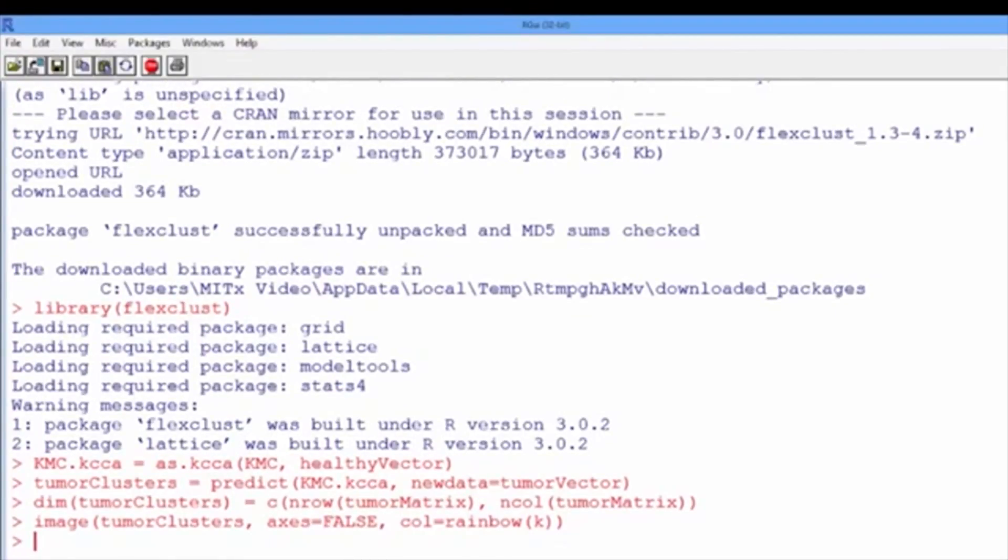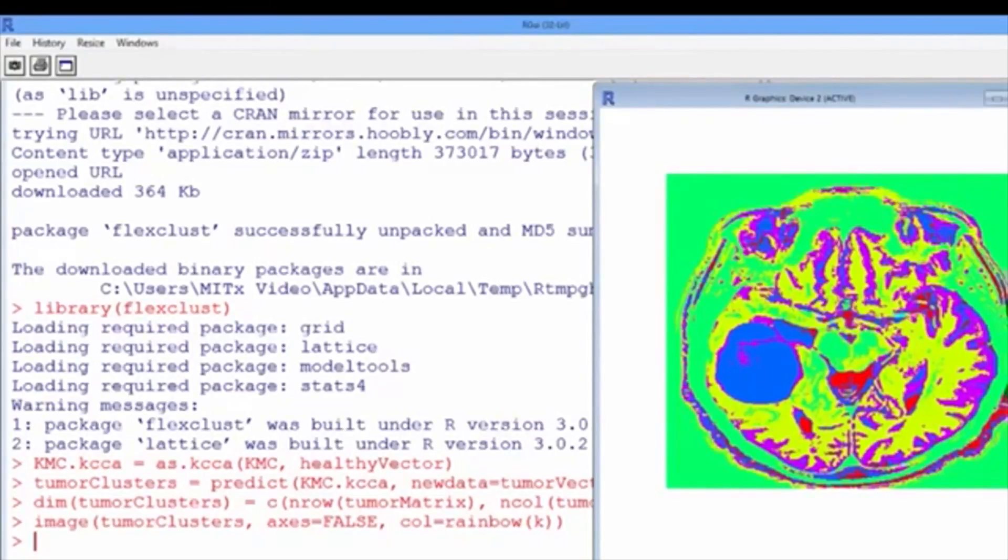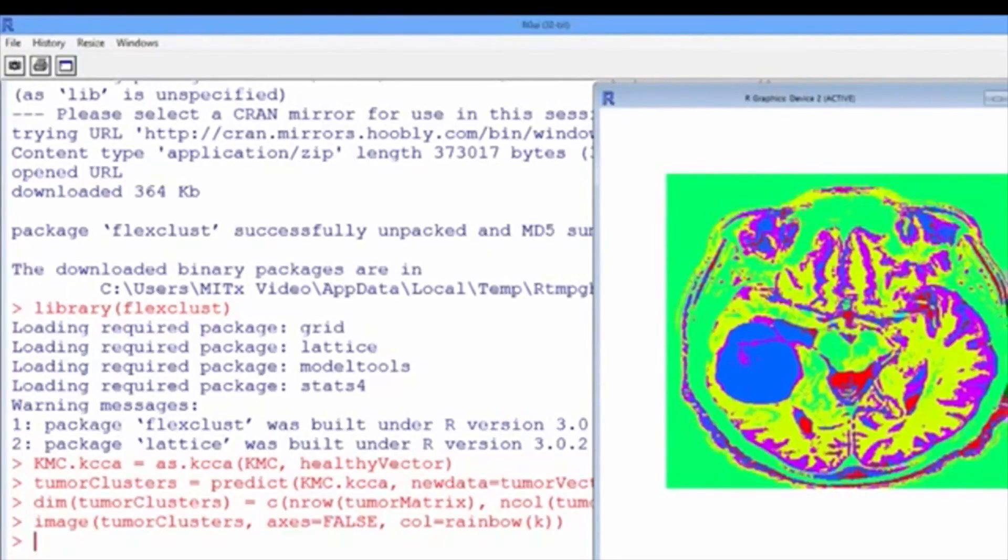All right. Let's navigate to the graphics window now to see if we can detect the tumor. Oh, and yes, we do. It is this abnormal substance here that is highlighted in blue that was not present in the healthy MRI image. So we were successfully able to identify more or less the geometry of the malignant structure.